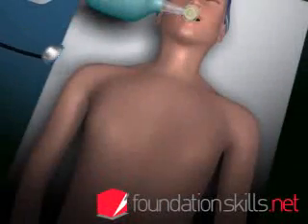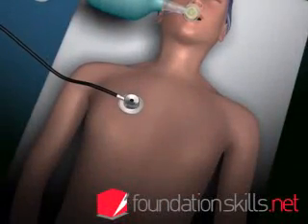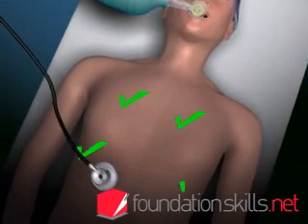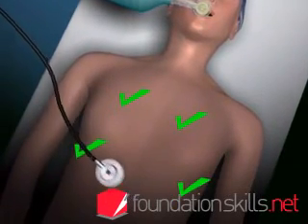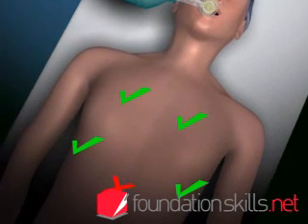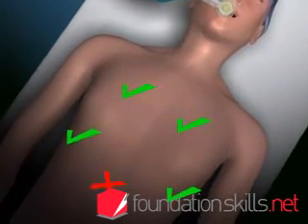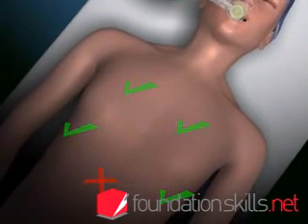Confirm the position of the tube by auscultating over the apices of the lungs, the axillae, and the stomach. If it is not in the correct position, deflate the cuff and remove the tube. Resort back to bag and mask ventilation and repeat the intubation process from the beginning.